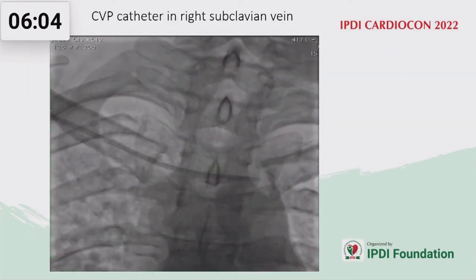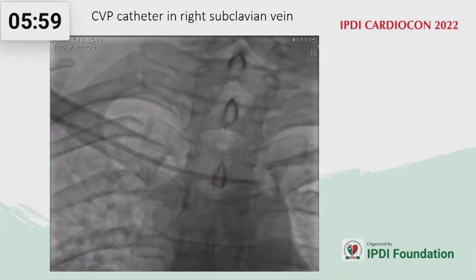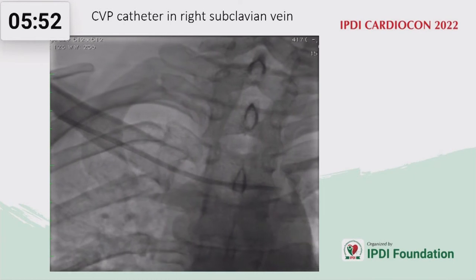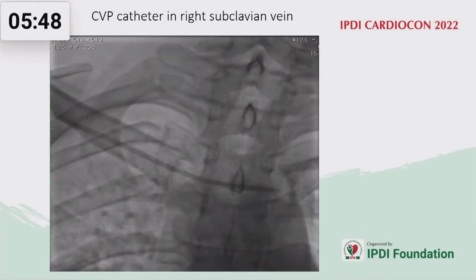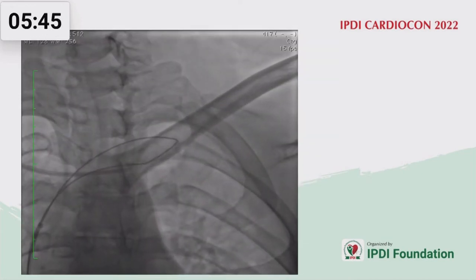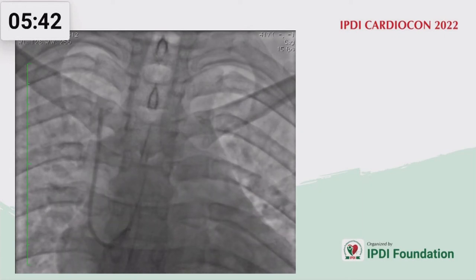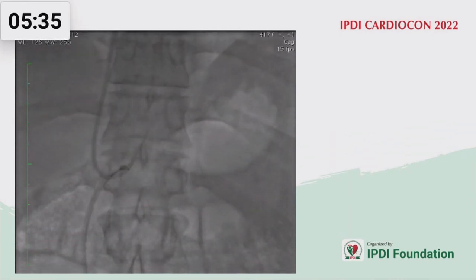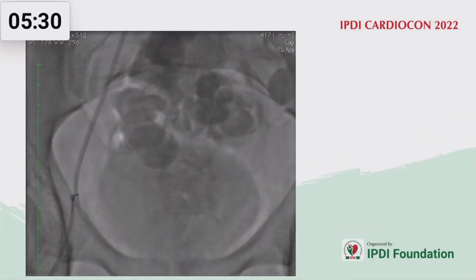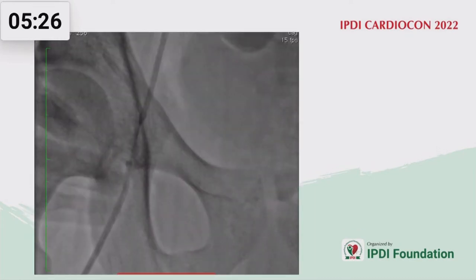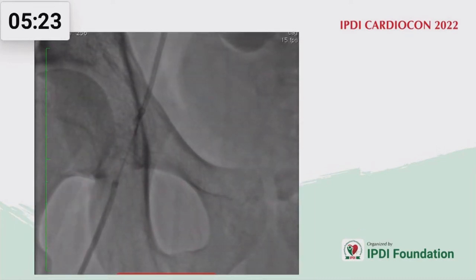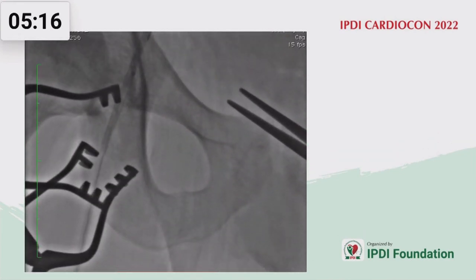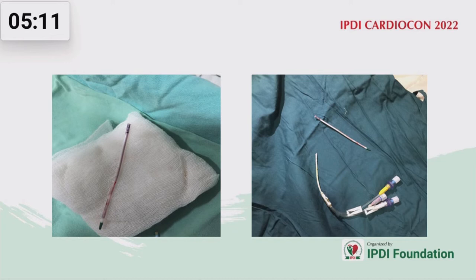This is another case — a patient in ICU who had a central CVP line. After the third or fourth day, when I was trying to take it out, the catheter broke in the subclavian and brachiocephalic veins. So I tried to snare it out, but it was not easy — I nearly struggled for one hour just to fix and retrieve this catheter. This is a central venous line that was retrieved.